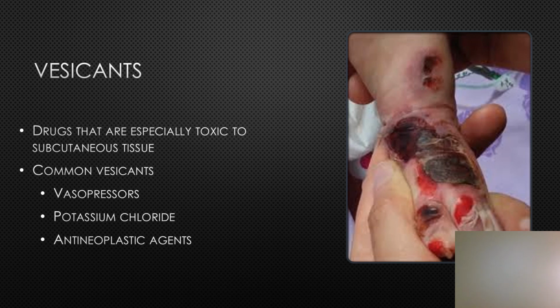The smallest appropriate cannula should be used. Ensure that cannula placement is patent prior to the administration of a vesicant, and flush the cannula after a vesicant is administered. Common vesicants that we do administer would be vasopressors, potassium chloride, and anti-neoplastic agents.